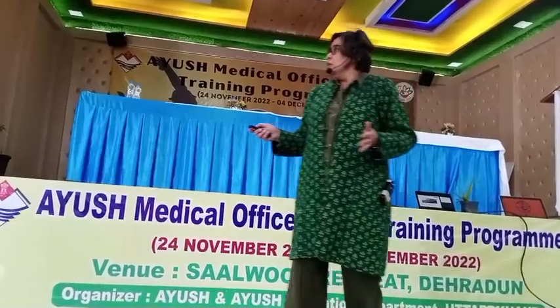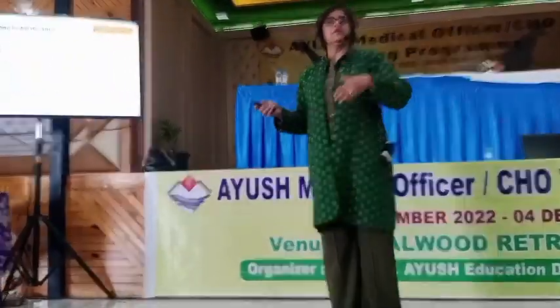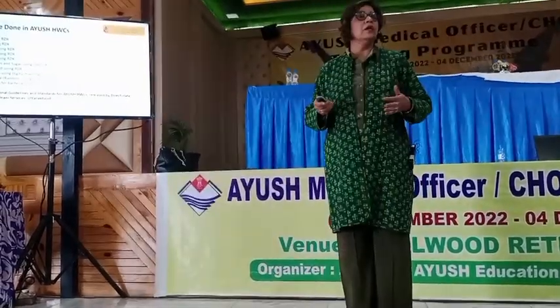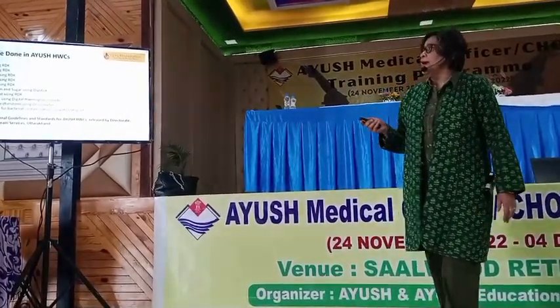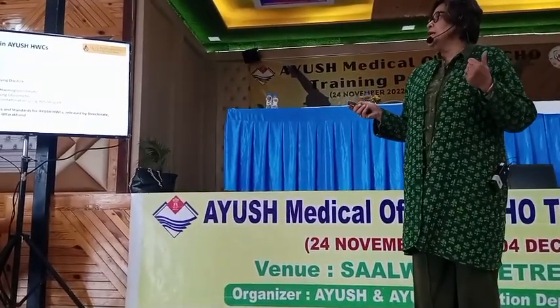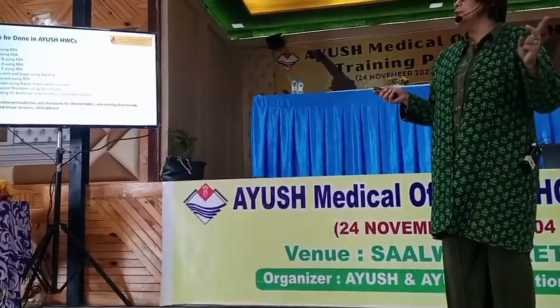So now, while I come to the process, these are the kind of tests which can be done at the AYUSH HWCs. One are the rapid tests: malaria, typhoid, hepatitis B, hepatitis A, hepatitis E. Urine test has two tests: one is urine albumin and sugar, and the other is a pregnancy test.